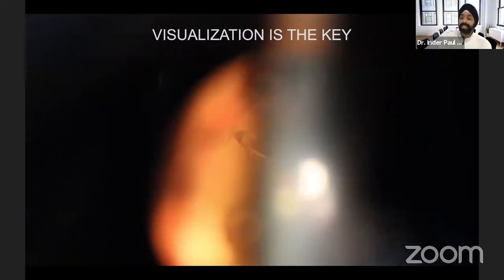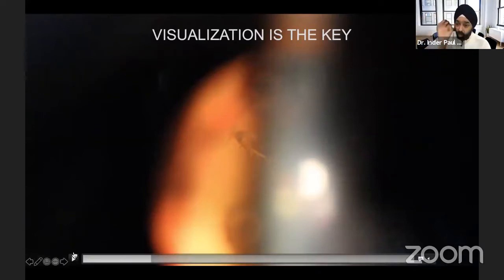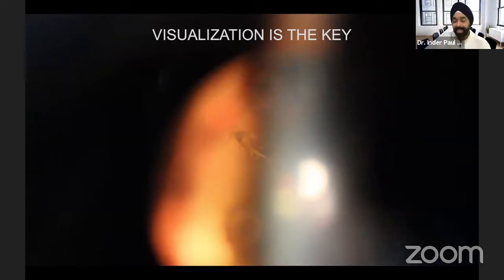So there's the retina. I can go posteriorly and I can see clearly those retinal blood vessels. Now I can go back to the floater to confirm that the floater is in focus and the retina is out of focus. This is why we feel comfortable from a safety perspective. We know exactly where we are. In any procedure in ophthalmology, we need to make sure we have good visualization. And this is what allows us to do that.